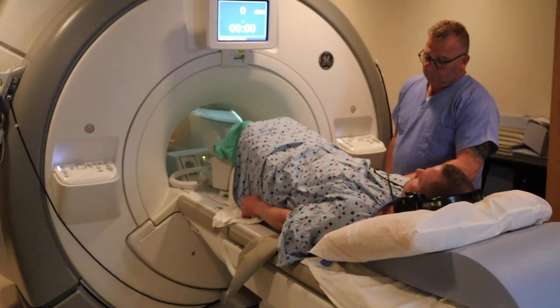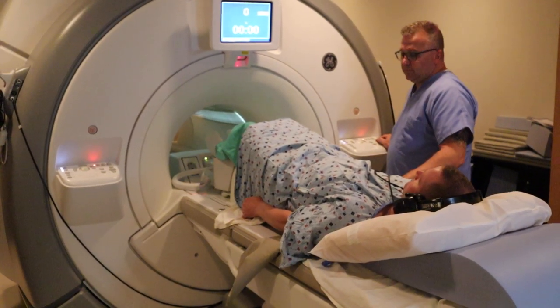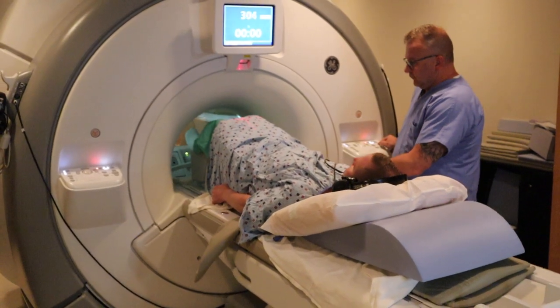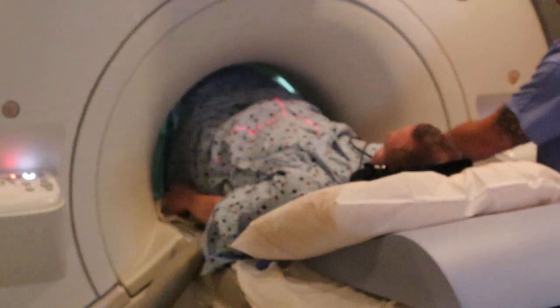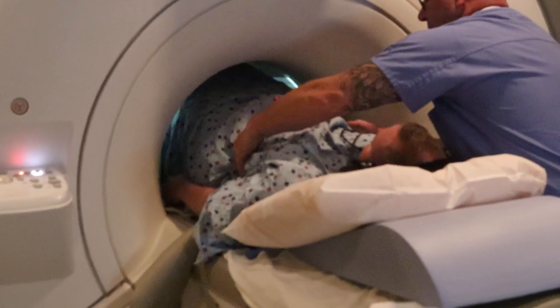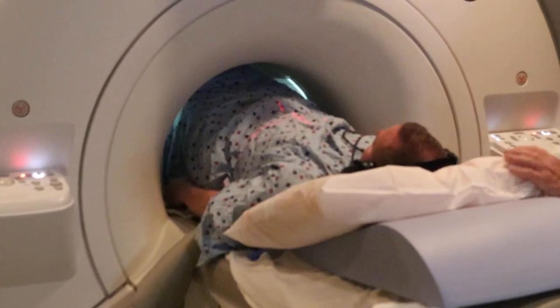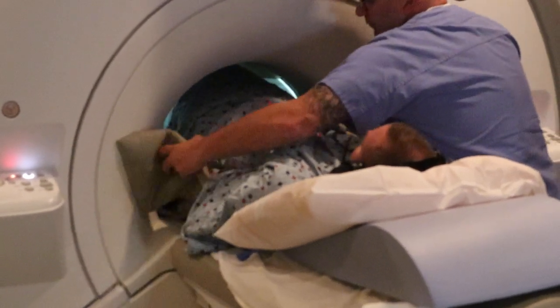You're going to go again three fingers above the iliac crest and advance the patient in. You want that alignment light three fingers above the crest. Perfect. You want the patient straight on the coil, with their mid sagittal plane running right along that center beam line.